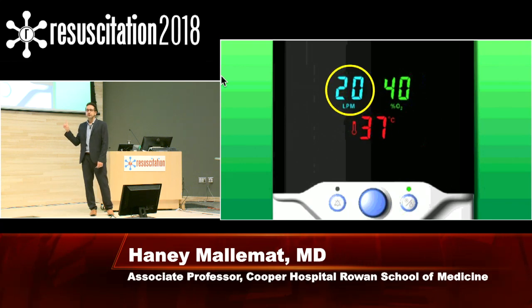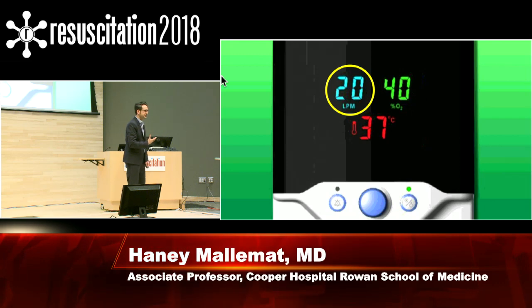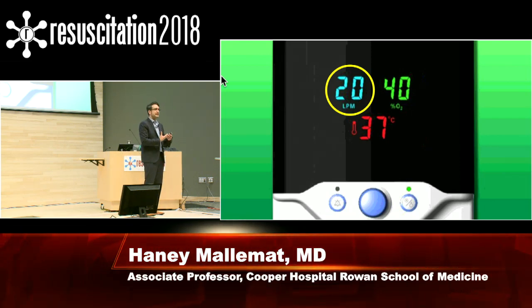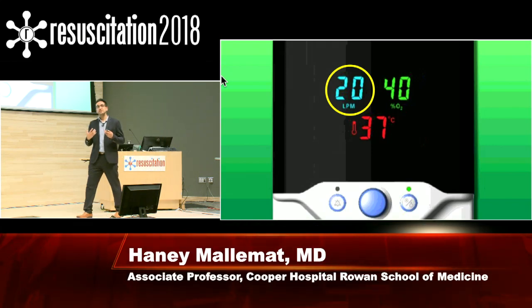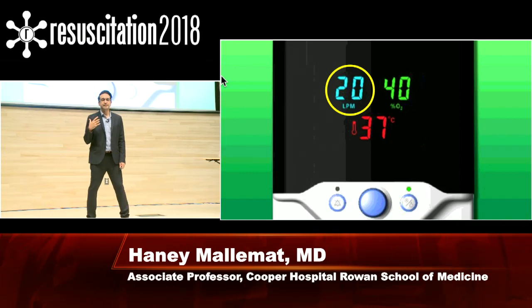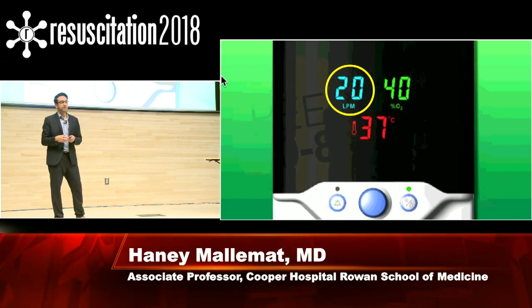But most importantly, you can titrate the liters per minute that you administer to your patients, and the higher the liters per minute, the more of that EPAP or CPAP that you're providing to your patients. So higher flows get you more splinting. Some of these devices go up to 80 liters per minute, quite high. So far, no one's head has exploded, but it is quite a bit of flow, and you can generate a lot of PEEP for these people.